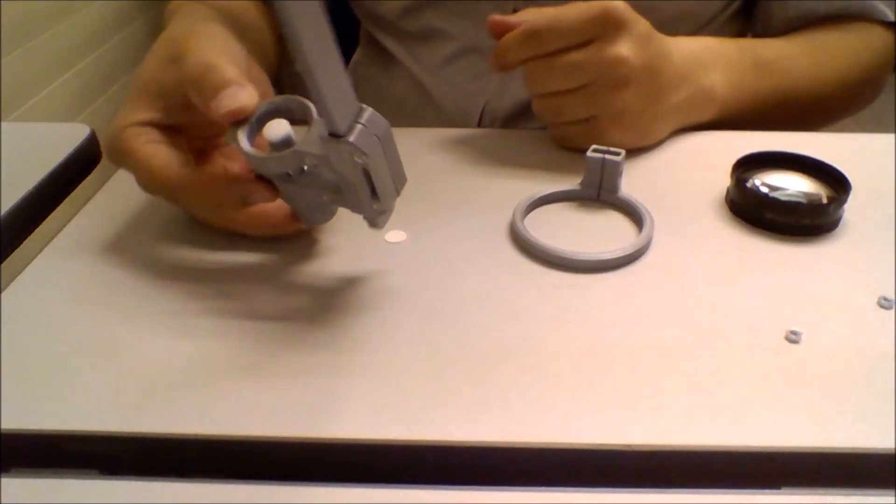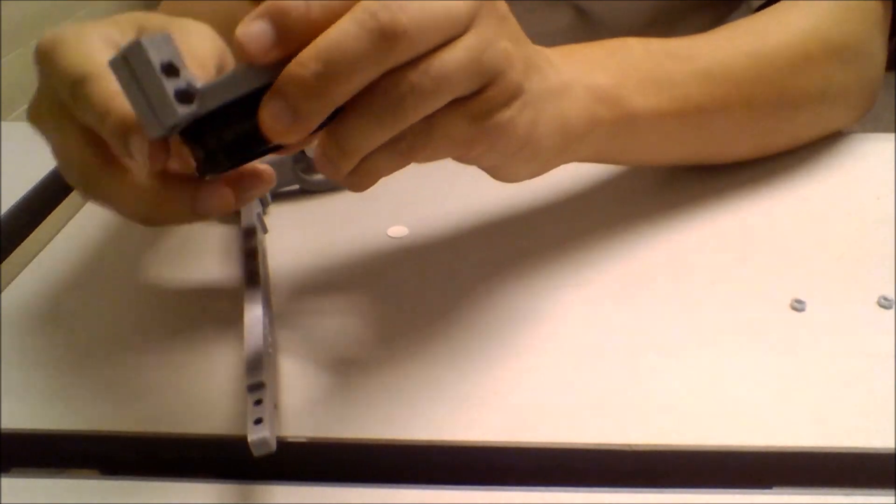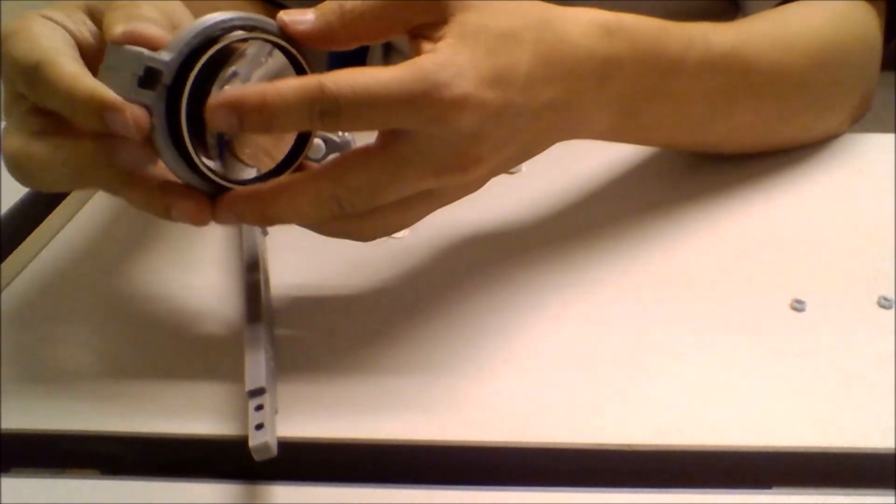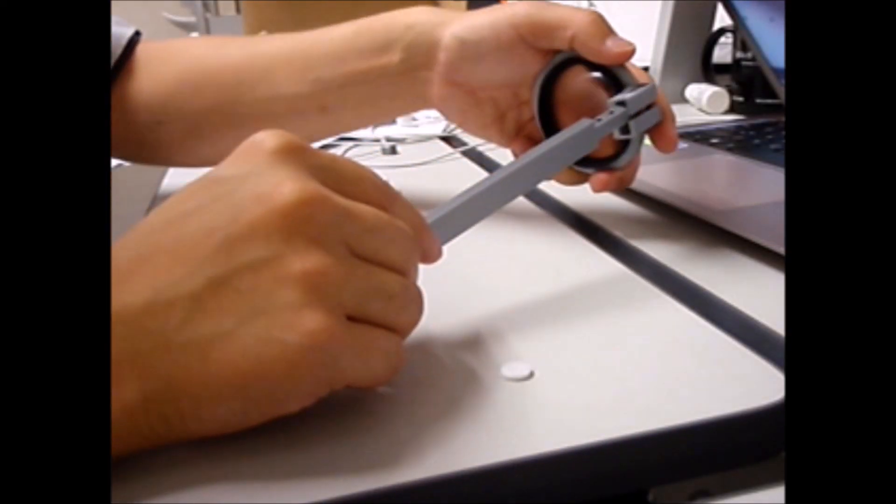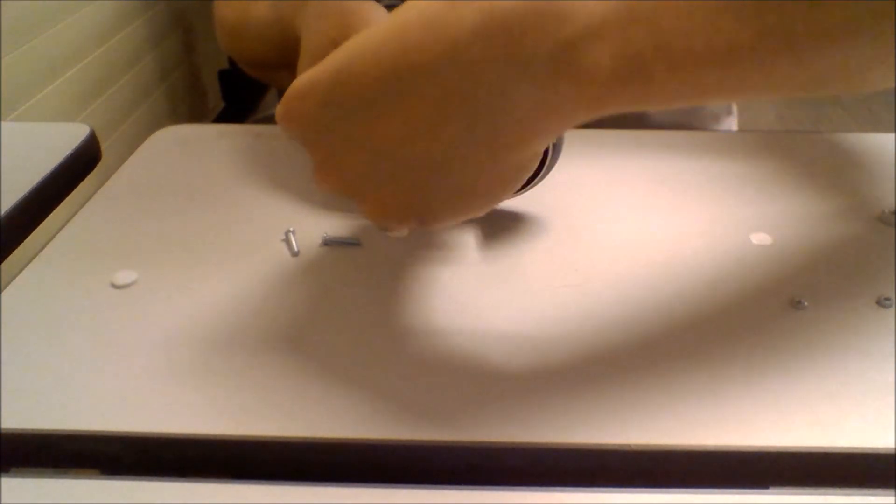Then, place the 20 diopter lens onto the lens mount. Attach it onto the lens arm and secure it with two M3 bolts and nuts.